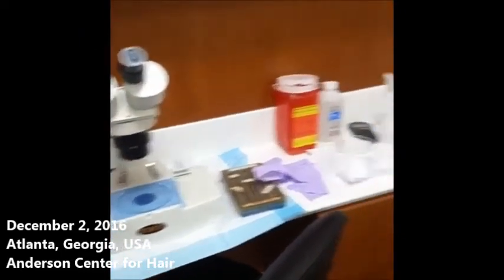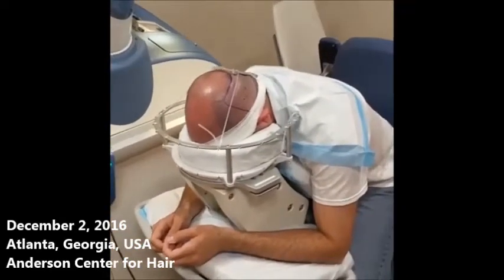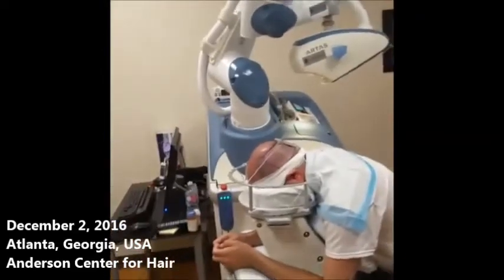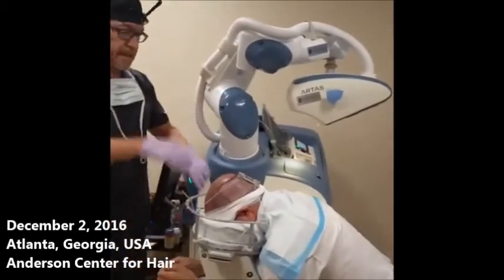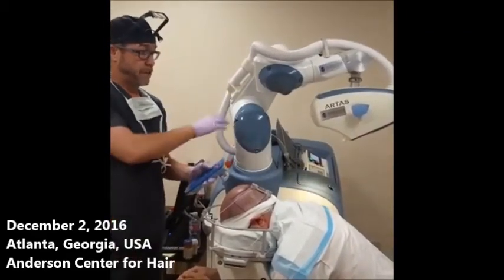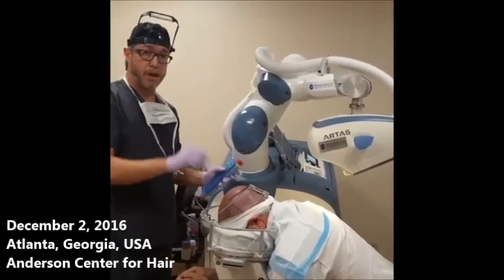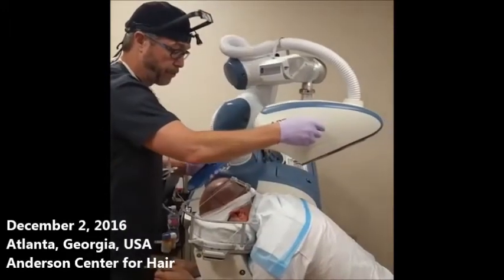I really believe microscopic dissection is the way to go. The old-school way is to just use loops, but we really believe in microscopic dissection. I'm going to take the fob in hand and bring the six-jointed robotic arm in — you can see it moves very smoothly. There are two stereoscopic cameras in there I'm going to show you in a moment. I'm just going to manually bring it in and converge these lasers.